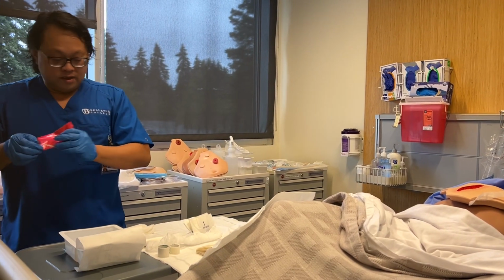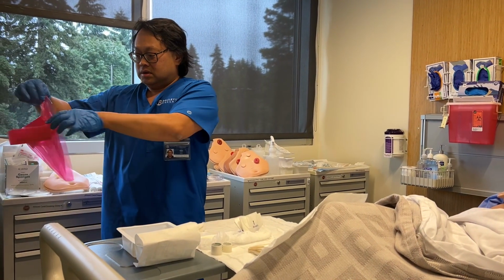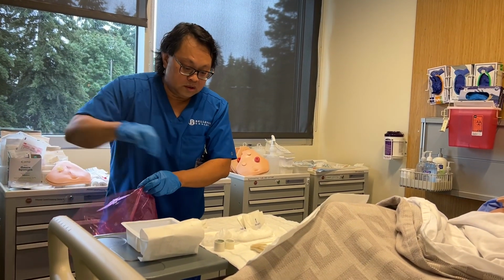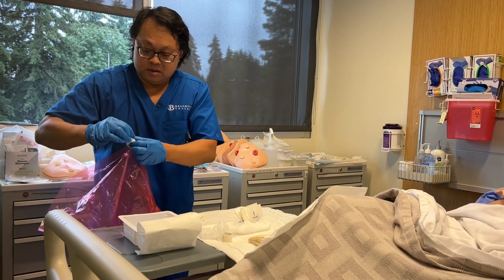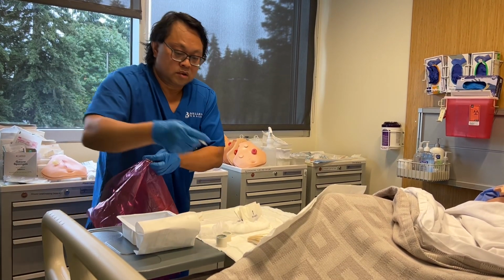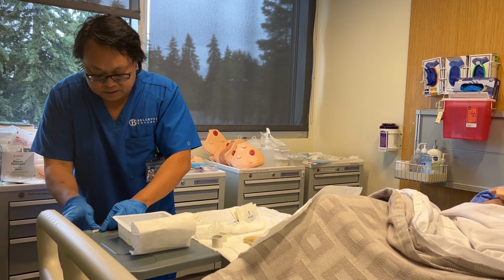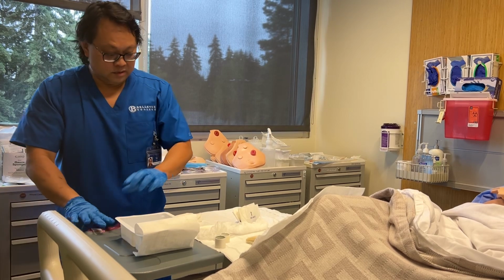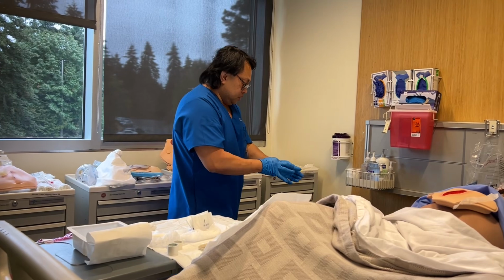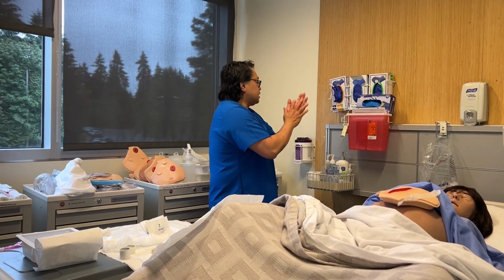Set my garbage bag. All right, now I'm going to put on my sterile gloves, so I'm going to change. I'm going to sanitize.